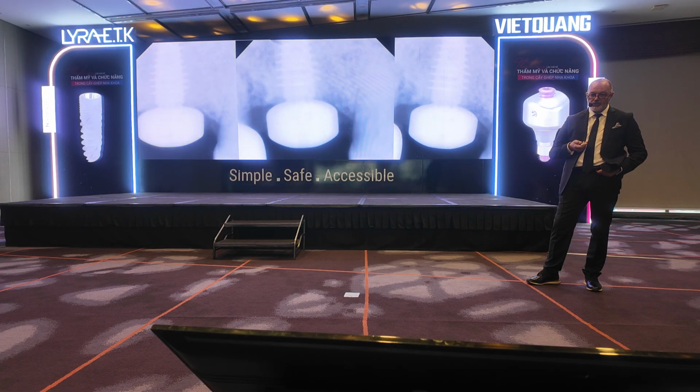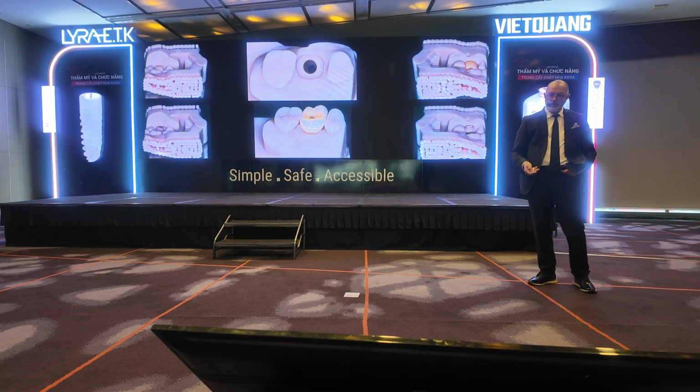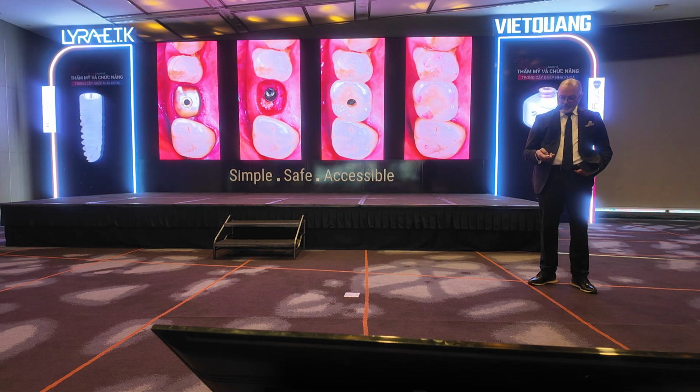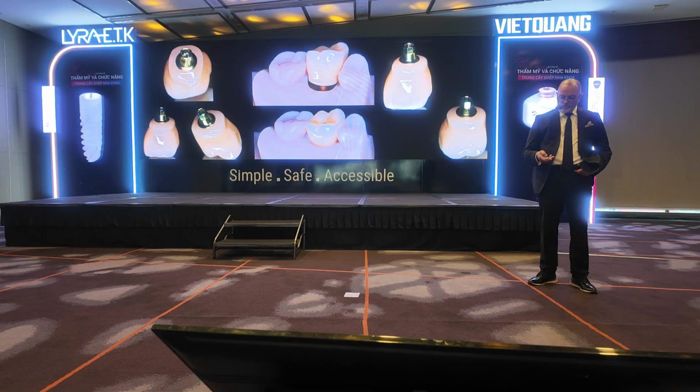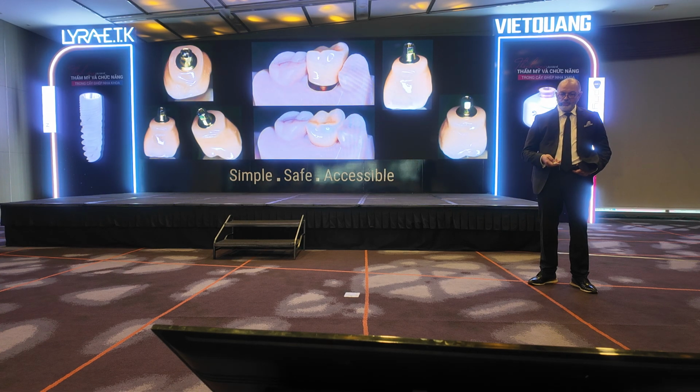And as you saw in the beginning, my abutment is really on the bone. And this is very, very beautiful. These are printed models where you can see here the inside after we remove exactly the shape of the iPhysio before to finalize the crown, which is done always in zirconia.